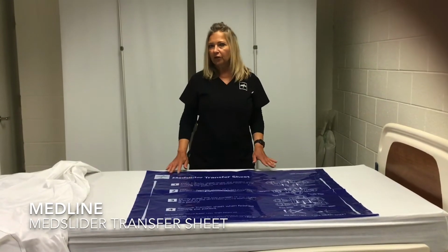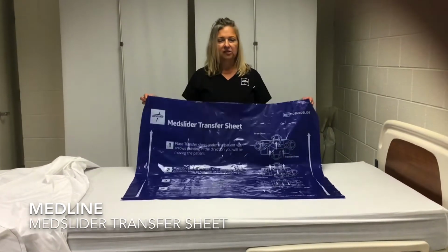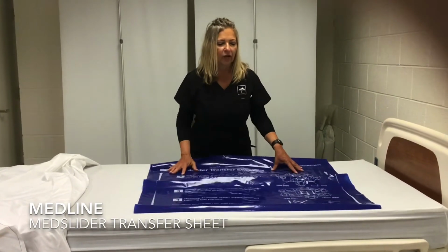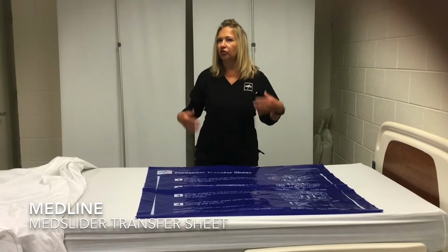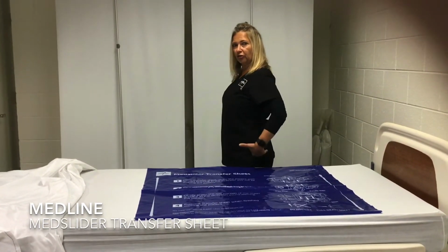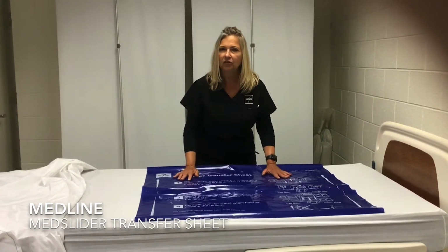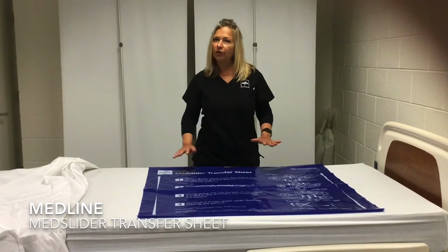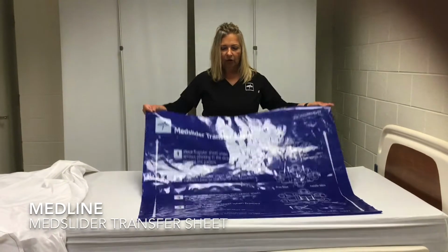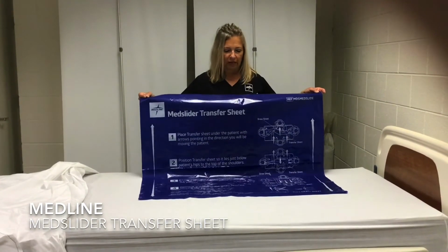So some quick little tips. The size of the slider is a perfect size to fit under a patient and under the largest part of the patient, which is their torso. So it fits under their shoulders to their hips. And that's where most of the weight is, so that makes it easier to slide them up or down or across. So there are directional arrows on the slide sheet to show you which direction to slide a patient.